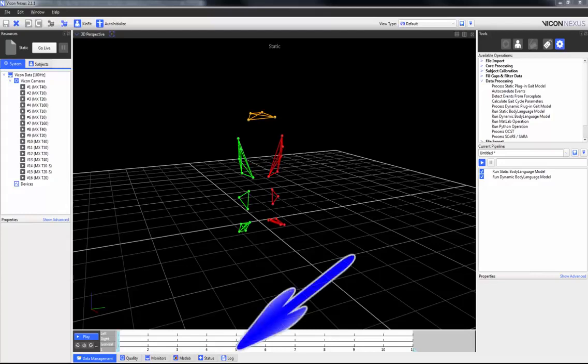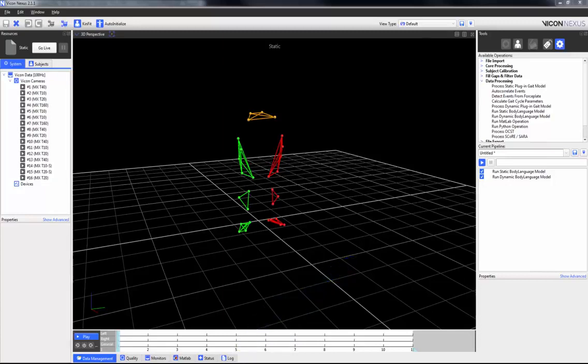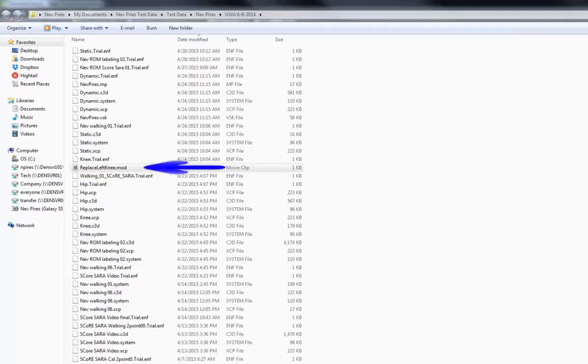If the script fails for whatever reason, you can debug by checking the communications log. There are numerous things you can do with BodyBuilder and the body language scripts. I'm going to show you a simple script that is used in both the static and dynamic body language model pipelines. The body language script is a simple text file with the file extension .mod.